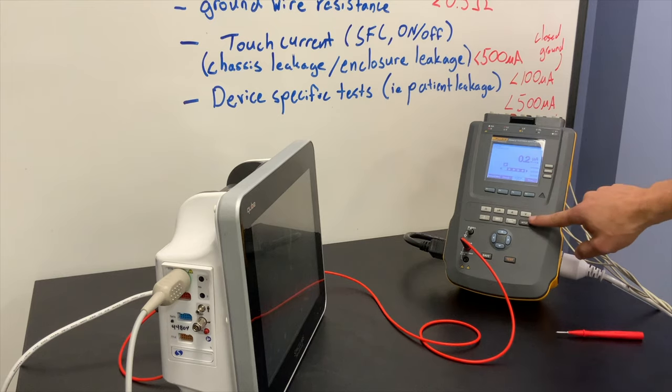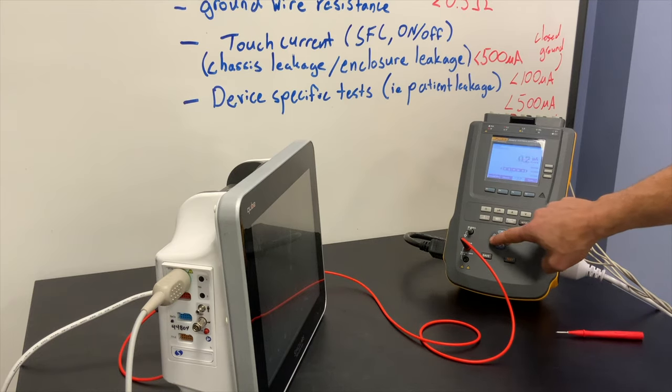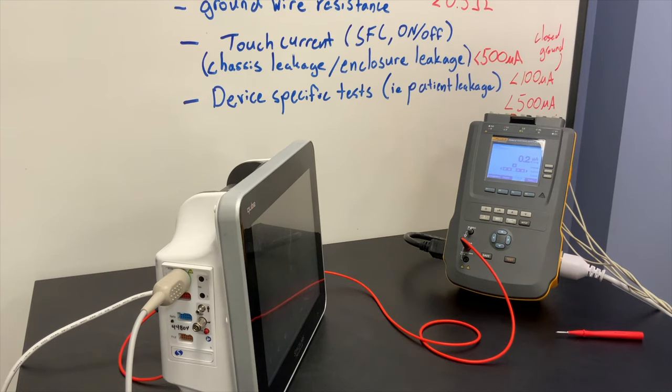I look at my testing conditions — normal polarity, neutrals closed, earth closed. I can cycle through the different leads to make sure they're all under 100 microamps right now. There are a bunch of different combinations testing between different leads in the system, and I cycled through them fairly quickly there.